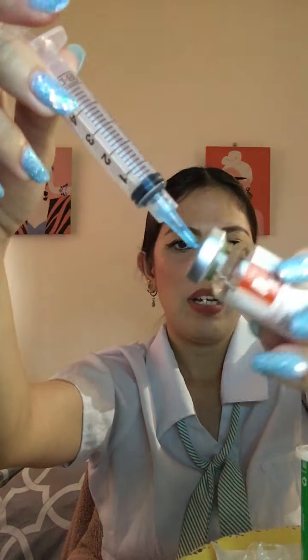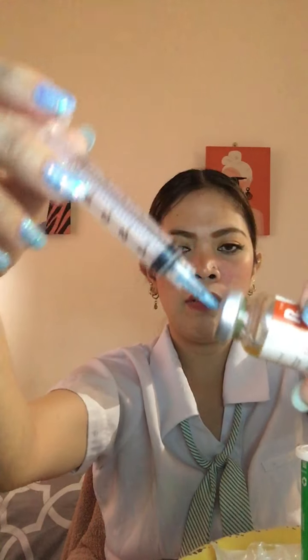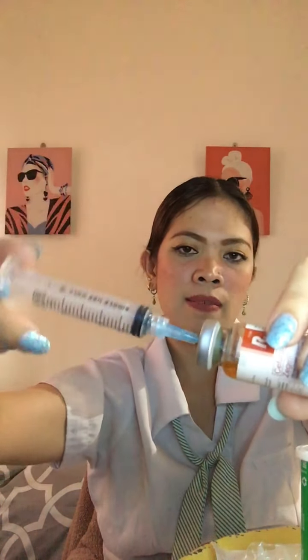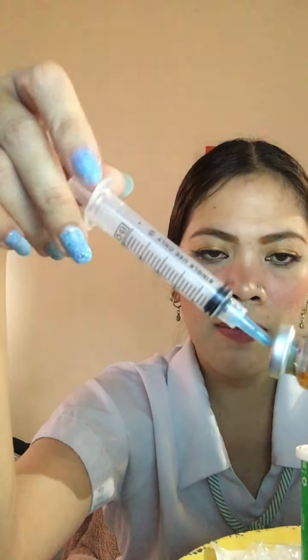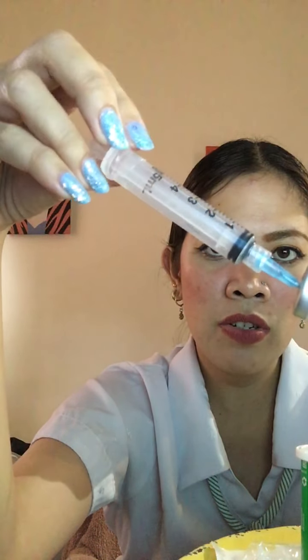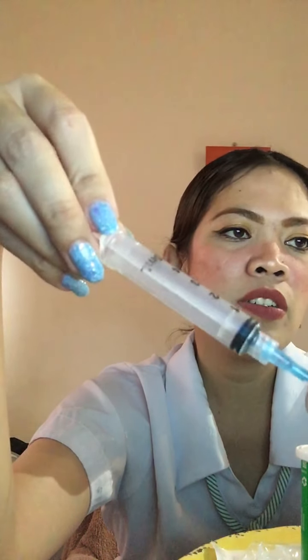Now all you have to do is slant or tip the bottle a little bit in order for the needle to reach the medication. Then withdraw the exact amount to prevent overdosage. It has to be the exact amount on the medication sheet.